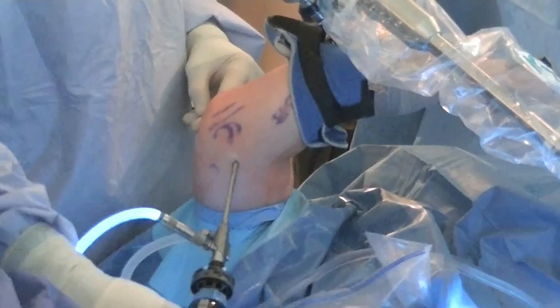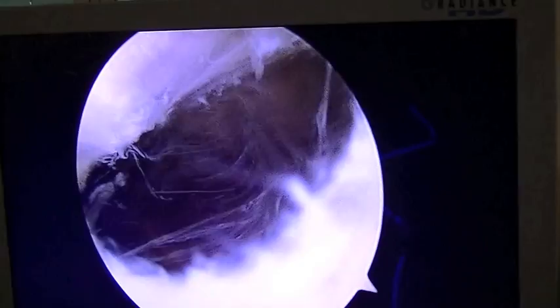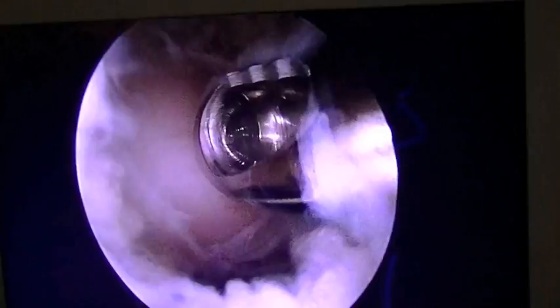The elbow is then manipulated to achieve full elbow extension. Once this has been completed, the medial collateral ligament reconstruction is performed using this medial midaxial incision.